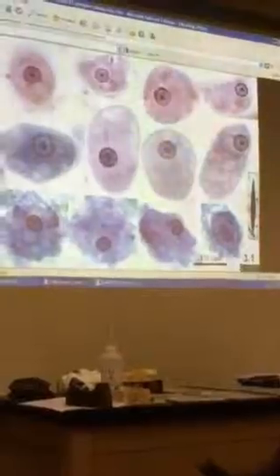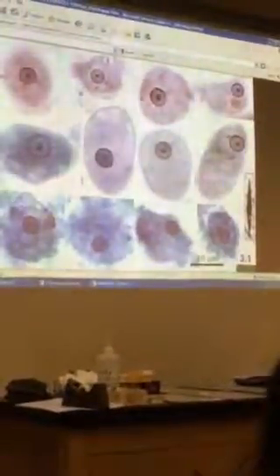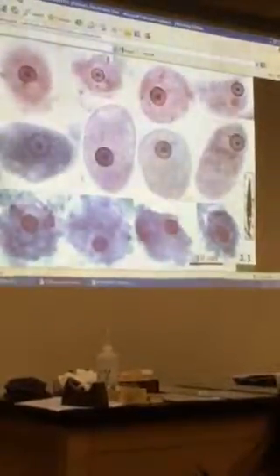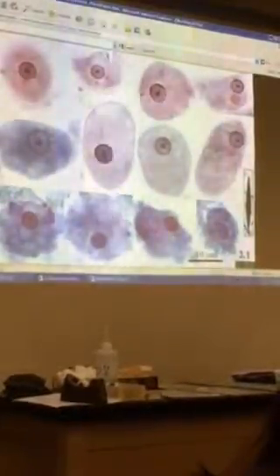It doesn't say it on this one. Okay, but that is a characteristic. Sometimes you probably won't see it on the practical, but while you're looking for these guys, you might see these real fusiform crystals in there. Let's see what John Sullivan has to say about that.